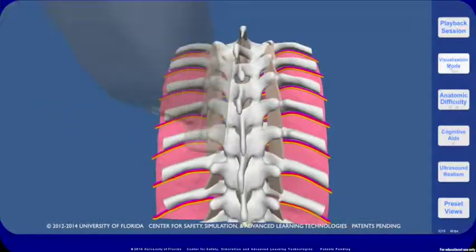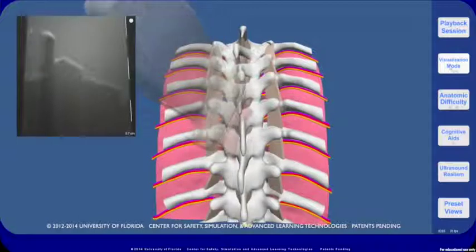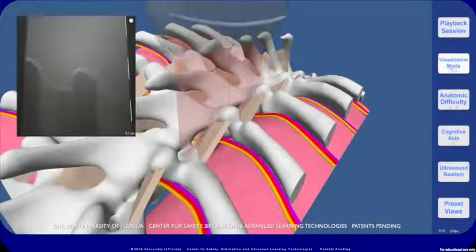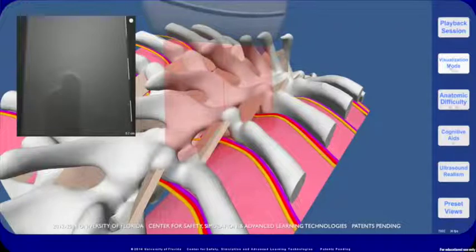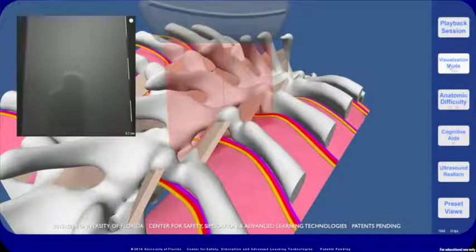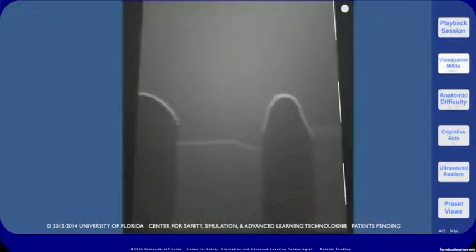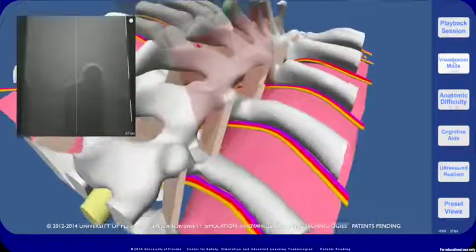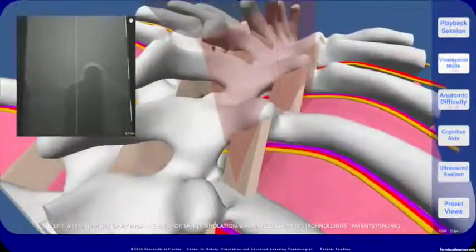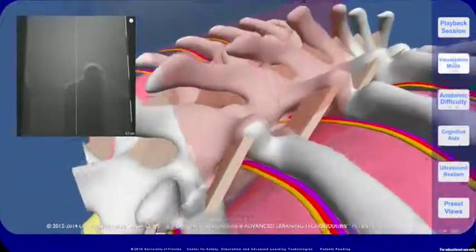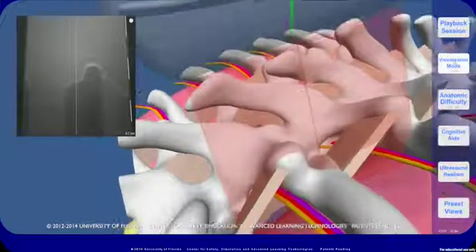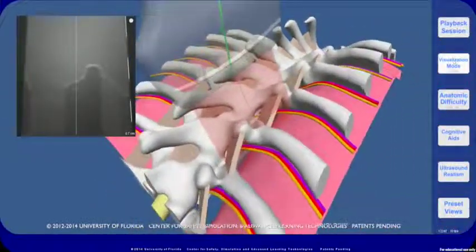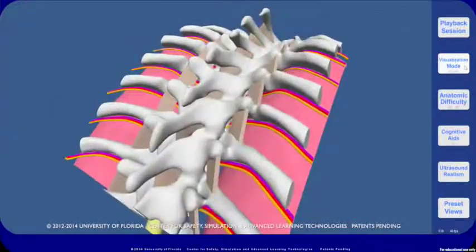The simulated ultrasound images are generated in real time according to the position, orientation, and applied pressure of the physical probe that is tracked in space. Markers show depth in centimeter increments. Cognitive aids can be used to draw a midline over both the virtual ultrasound image and the insonating plane within the visualization.